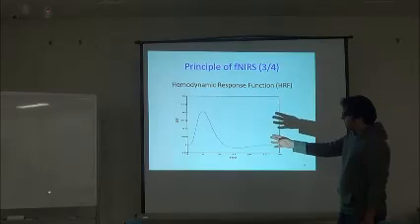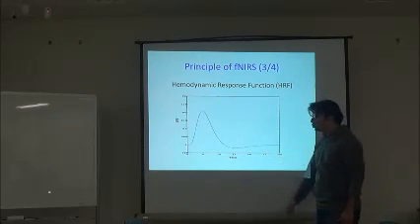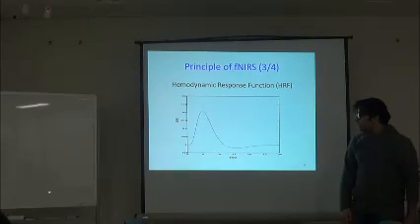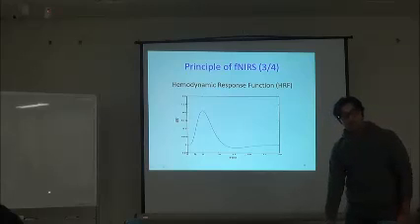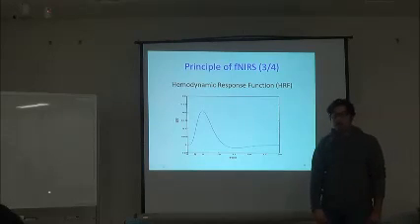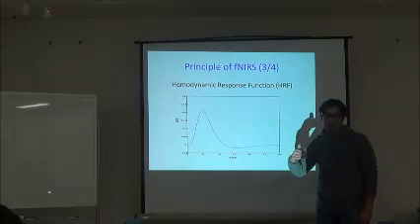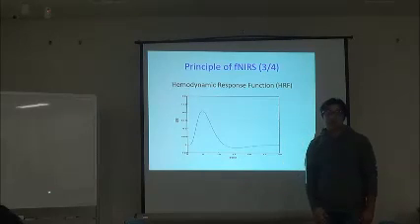All of this process, the complete process of stabilization, takes 20 to 21 seconds, and the onset of this slope is around 2 seconds. So basically the oxygenated hemoglobin concentration starts to increase after 2 seconds of the activity.